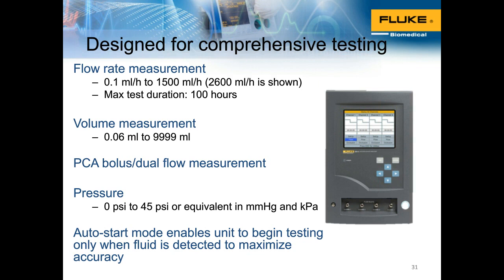At the end of it, Answer will give you a report that you can store in the software format that we have, which is by default the Answer format, or in a PDF format that you can then attach to your CMMS work order.